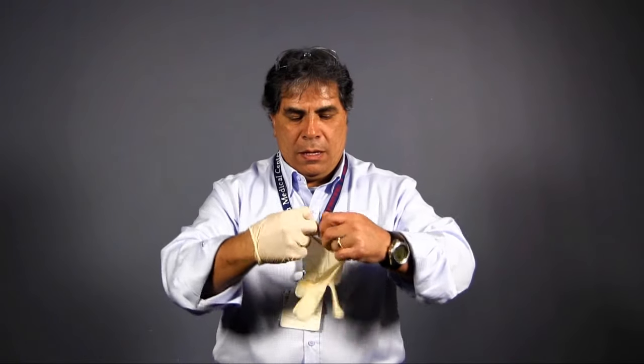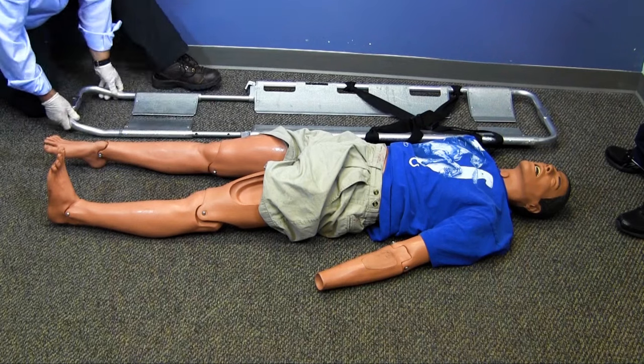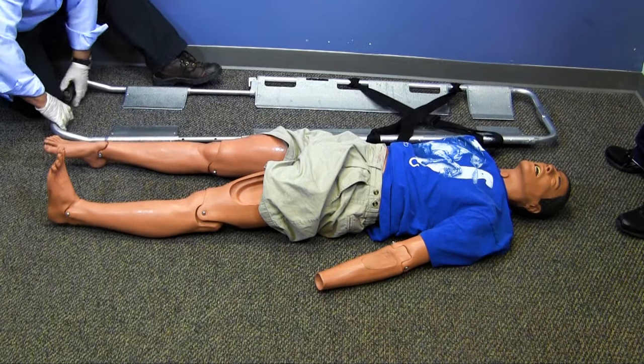I will first don my BSI. For this skill, I will be using gloves. If I believe there is a risk of cervical spine injury, I will direct my partner to maintain cervical spine immobilization. In this case, that is not a concern. I will size the scoop stretcher to an appropriate length and separate the two sides.